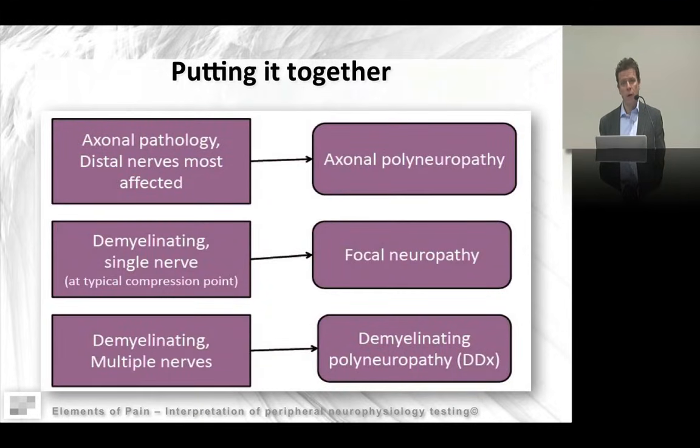You do that for the various nerves, motor and sensory, and put things together. The general pattern we look for will be that it's normal, or there may be a focal lesion. The other possibility is generalized axonal changes, with reduced amplitudes and relatively normal latencies and velocities, which is the general pattern of an axonal peripheral neuropathy seen with diabetes and various other conditions.